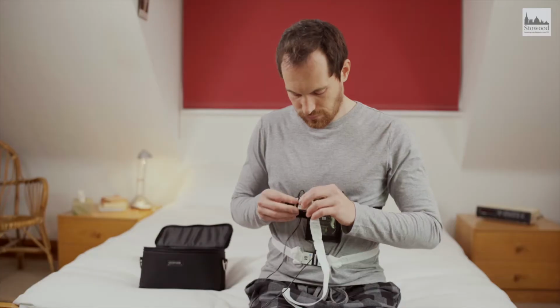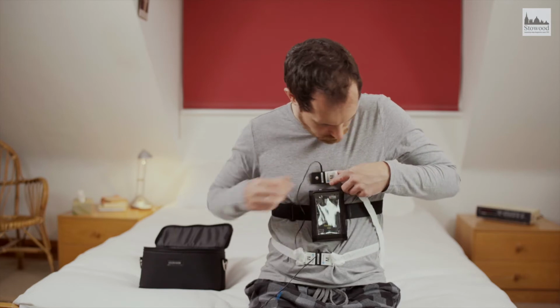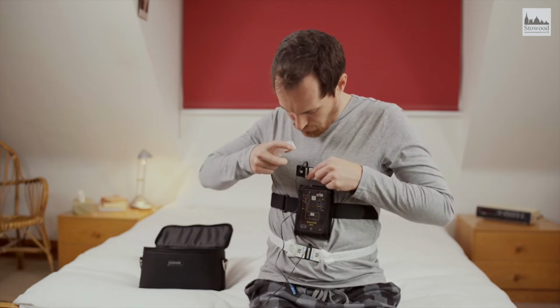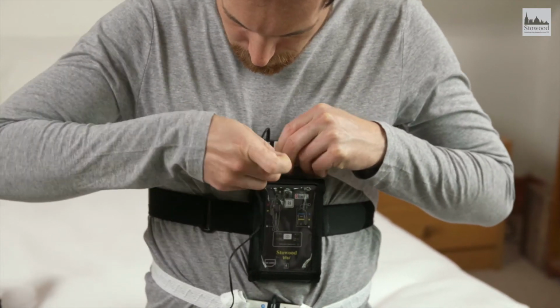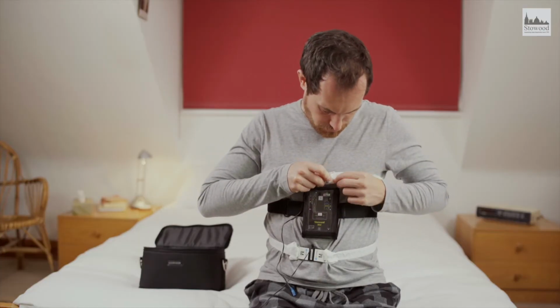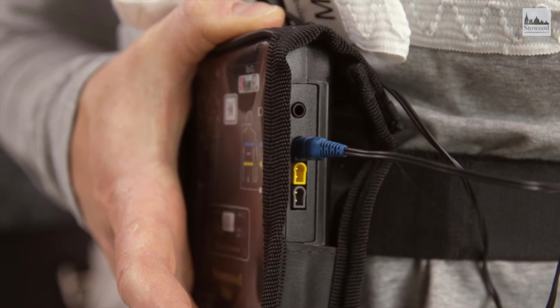Do the same for the thorax band, which has a blue plug. Place it around the chest above the device. Keep the strap below the armpits but above the breasts. Then plug them into the blue and yellow sockets of the sleep recorder.